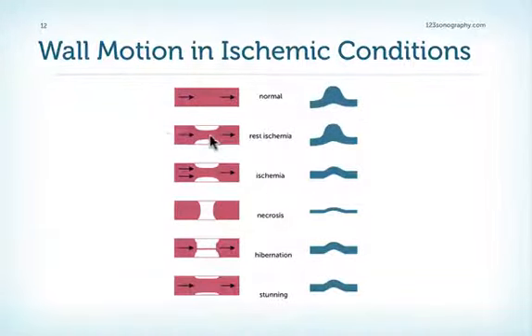If there's a stenosis, however, perfusion is adequate, we also have normal contractility. If there's a stenosis and during exercise perfusion is not adequate, the patient develops hypokinesis, for example, during stress echocardiography. The wall thickness, however, is still normal.